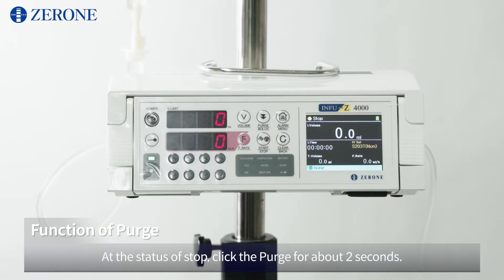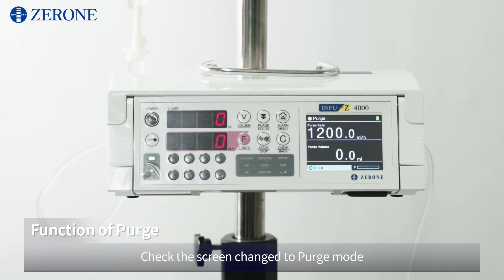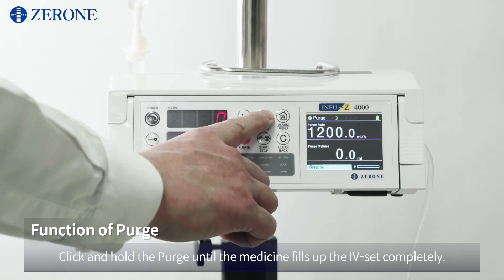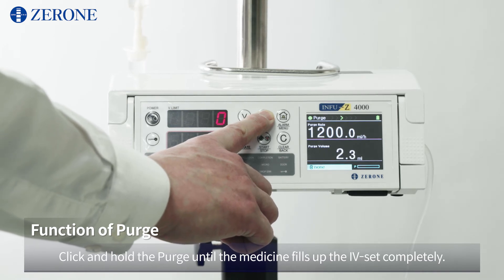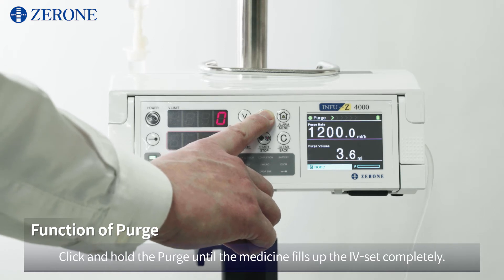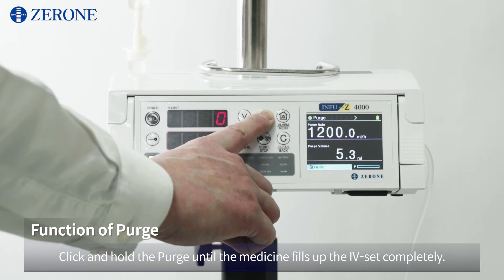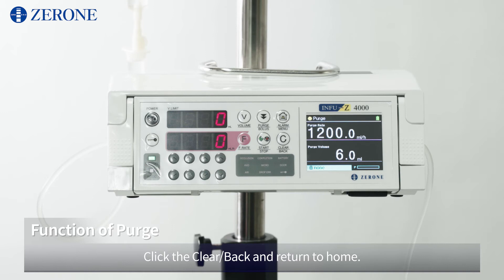At the status of stop, click the purge for about 2 seconds. Check the screen has changed to purge mode. Click and hold the purge until the medicine fills up the IV set completely. Click clear/back to return to home.